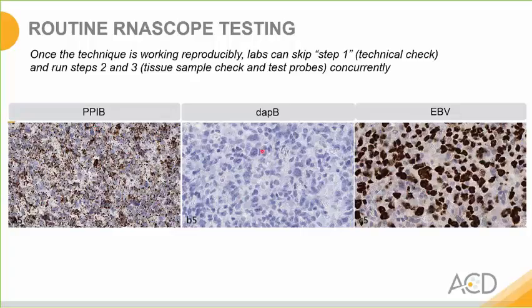No significant background staining, as indicated by the negative appearance of the panel stained for DAP-B. Then you have a very robust, strong signal for EBV. In this case, the dots are so numerous they essentially coalesce to create what almost looks like a diffuse immunohistochemistry staining pattern for the EBV.